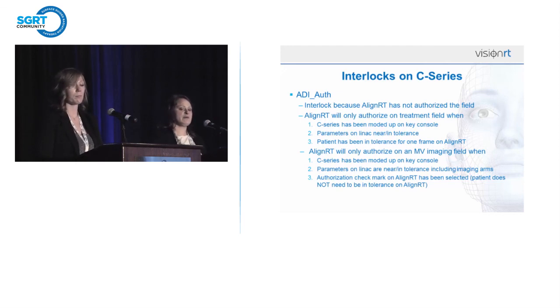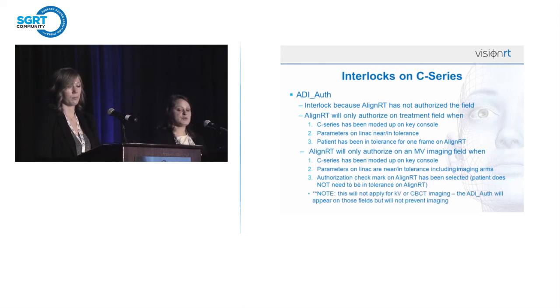One more thing to note about C-Series is that we won't interlock the KV or the CBCT. So even though you will see the ADI auth interlock, we won't actually interlock the beam. We'll only interlock on the MV until you select the authorized button.